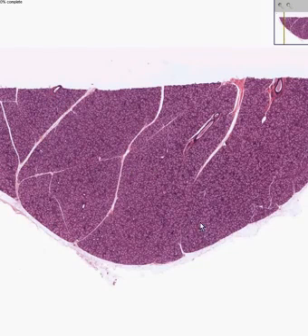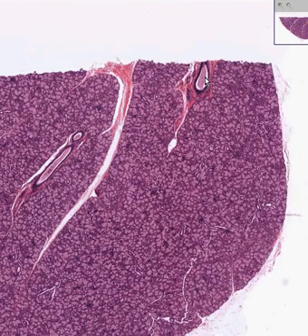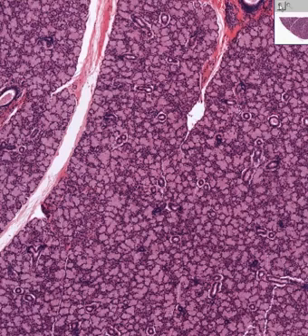And yet another salivary gland with a little bit of a capsule here, with some fibrous tissue septae creating these lobules. You could see that some of the ducts are within the septae, like here and here. So this would clearly be an interlobular duct, whereas the majority of these other ducts are within lobules, so they would be called intralobular.